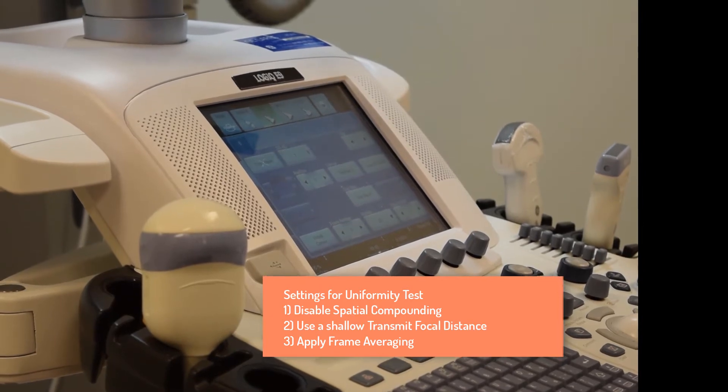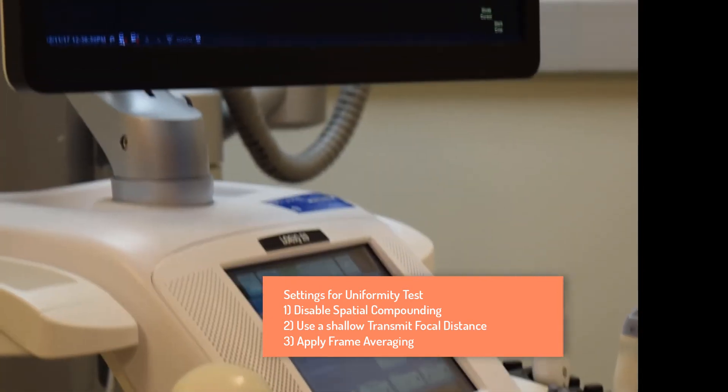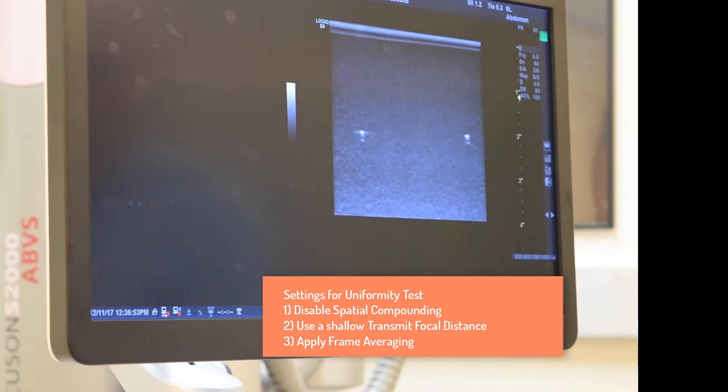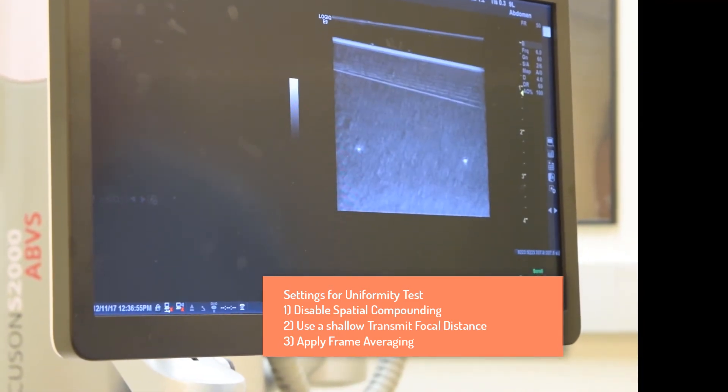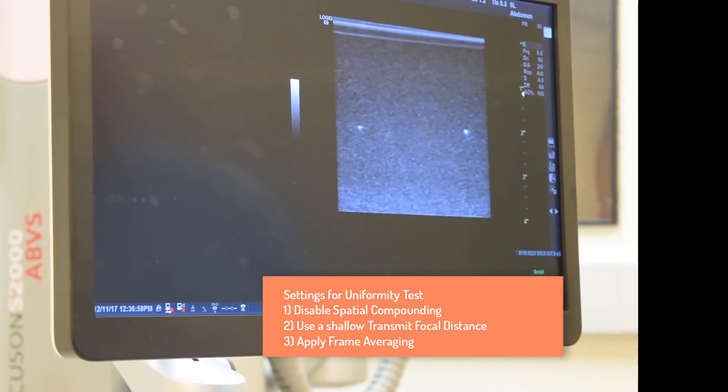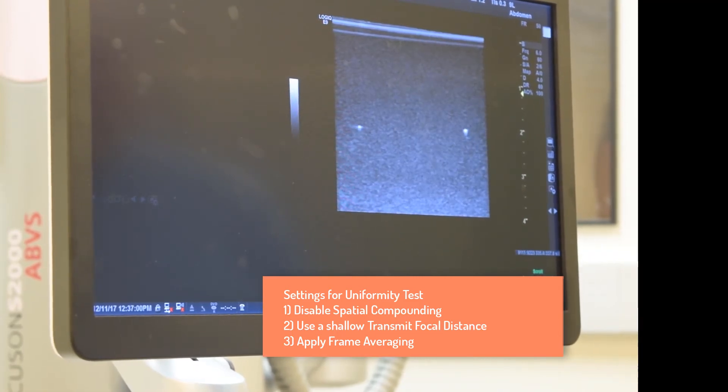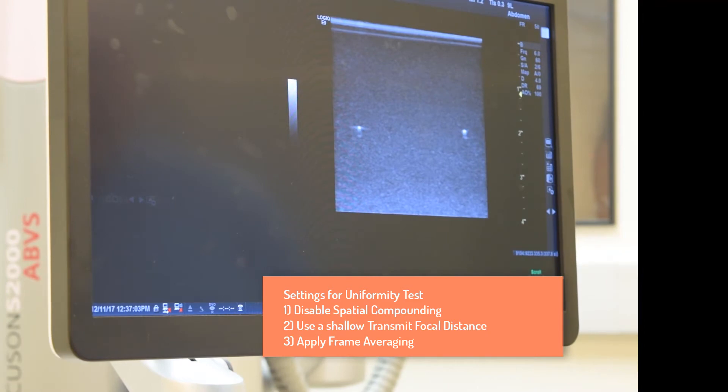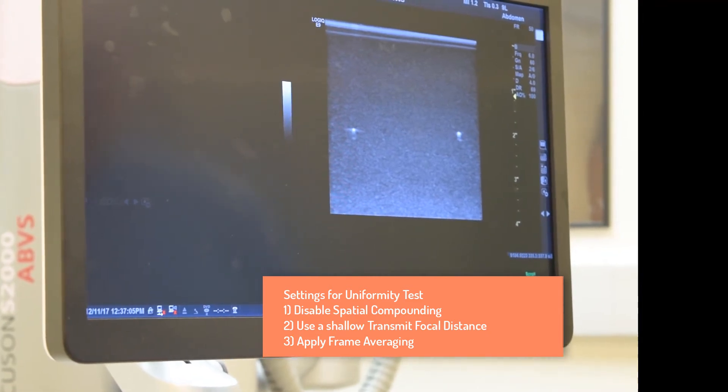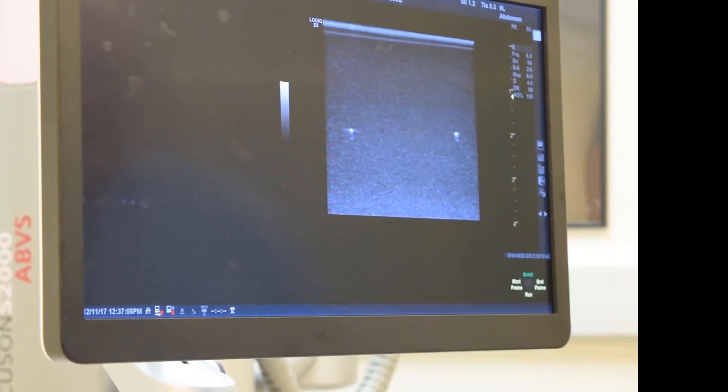So the suggested instrument settings for uniformity tests are to disable spatial compounding, use a shallow transmit focal distance, and apply lots of frame averaging while you move the transducer in order to try to smooth out the speckle pattern somewhat. Then we freeze the image and take a close examination of the result. This transducer looks quite uniform. I don't see any shadows, but there is this little bright spot that seems to emanate from the transducer surface.